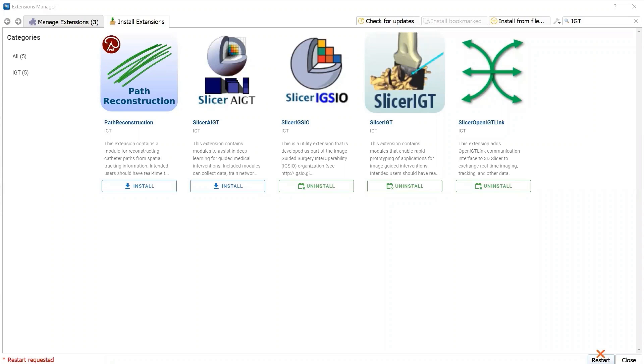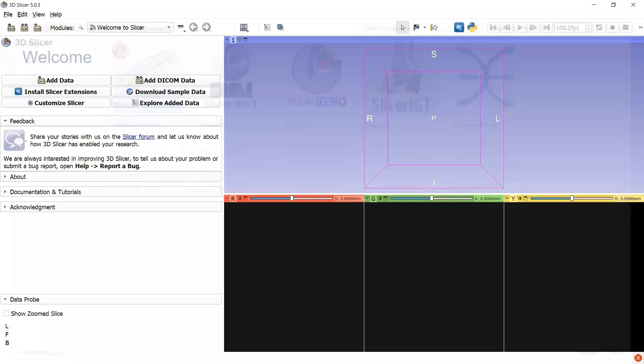It's not time to restart 3D Slicer yet because we haven't installed the extension SlicerIGSpineDeformity. We can do the restart after installing our custom extension, so that we only need to restart once.